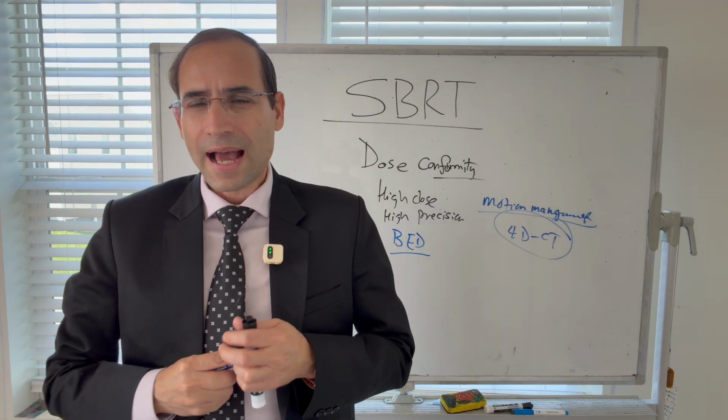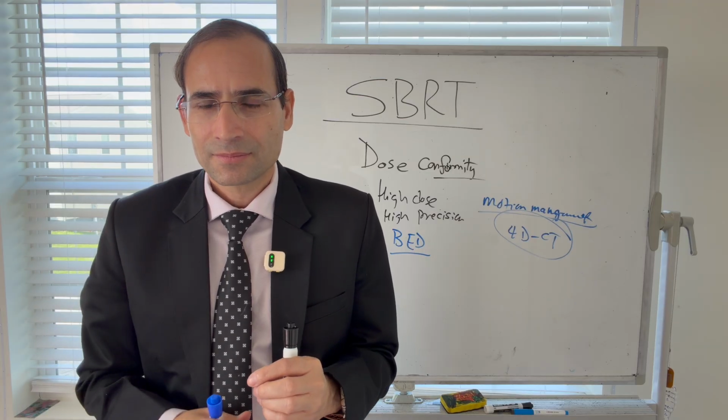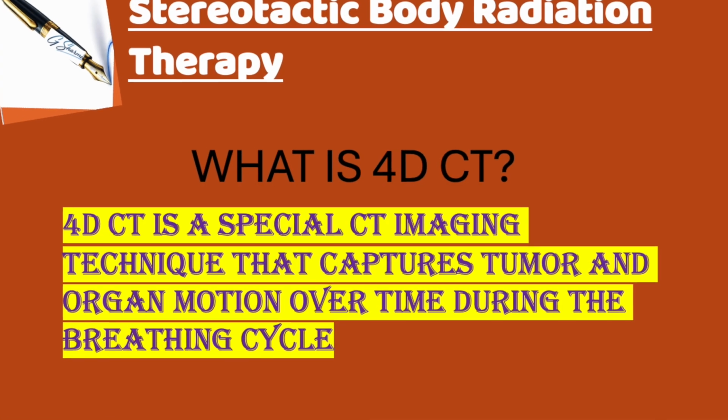So 4-dimensional CT. What do you mean by that? That means imaging the tumor across the breathing cycle. In 4D CT, we image the tumor across the breathing cycle. We take the image, inhale and exhale, both cycles.